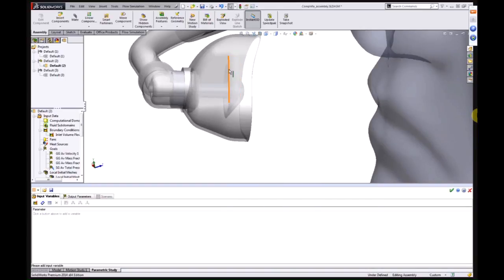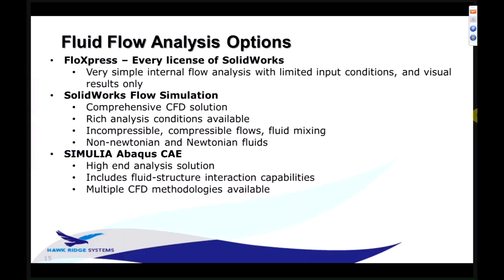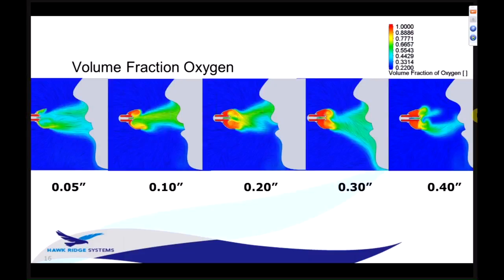If we switch back to PowerPoint, first they looked at one parameter. They looked at basically the offset of the little valve. How do things change as we push it from a very small throw, go a little larger, larger again. But this was a single setup. We had to hit run one time, and it went off and ran these 5 variations. And as you can see, there's some significant differences in the received oxygen for these 5 different cases. So that would be what we call a single factor design study.